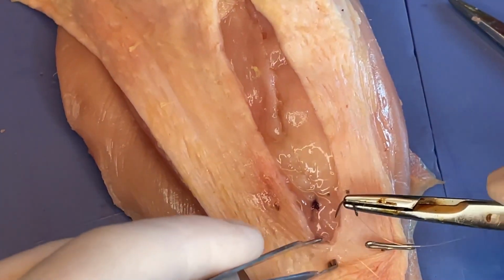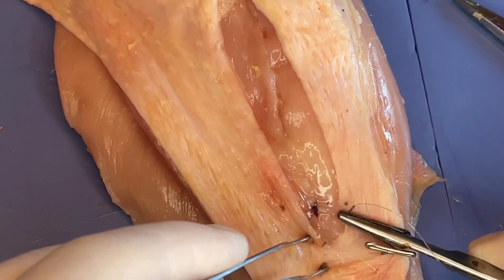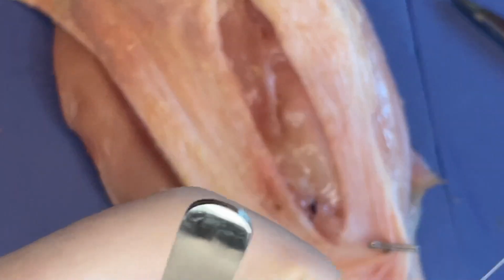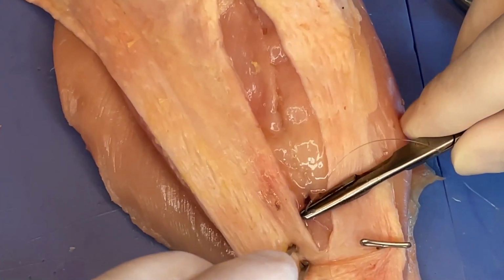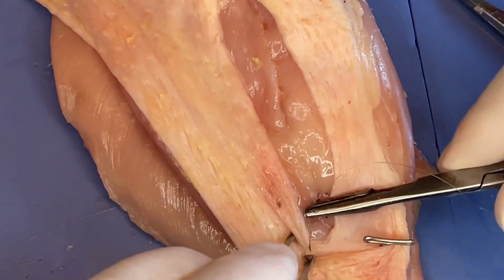All right, so our final bite here, coming out right at the apex where our skin edge is cut. And then one more little bite right through this side, again, kind of coming out right at the apex there, trying to not come through skin itself.